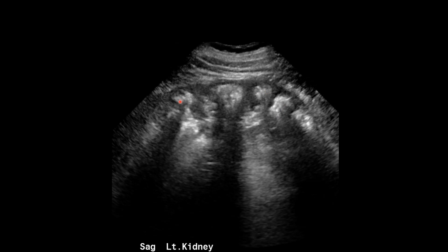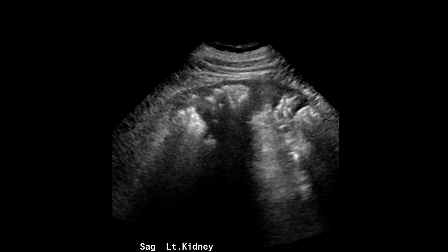On this image, you can see just how triangular and echogenic these pyramids appear, but the intervening cortex appears normal. So that tells you we're dealing with medullary nephrocalcinosis, not cortical nephrocalcinosis.